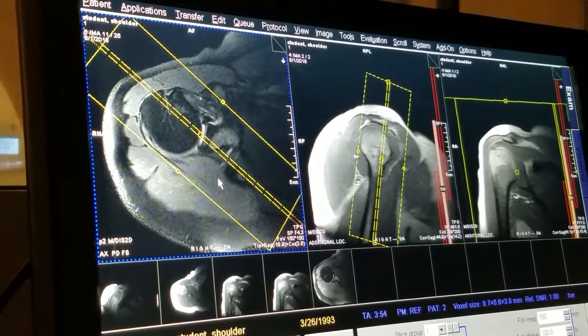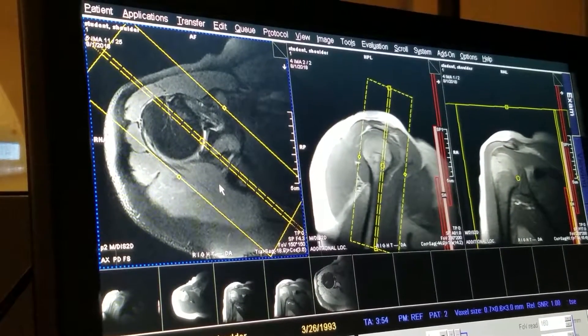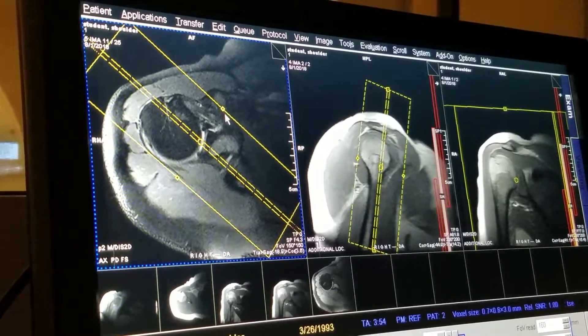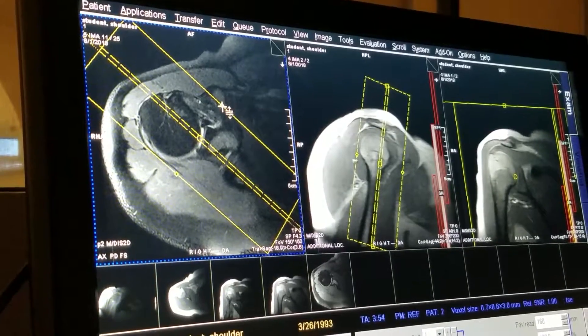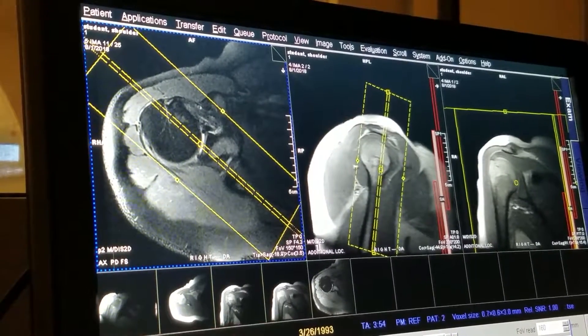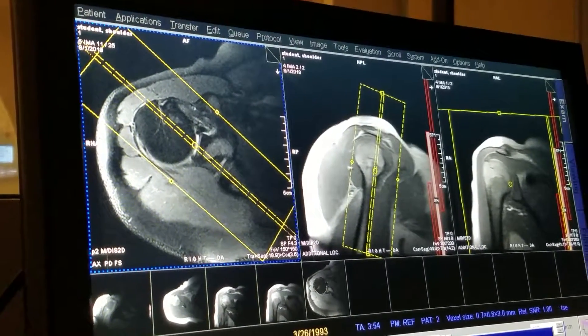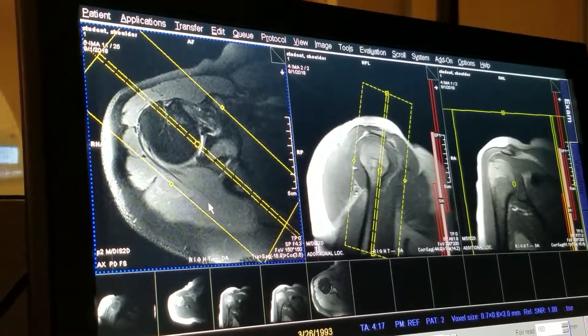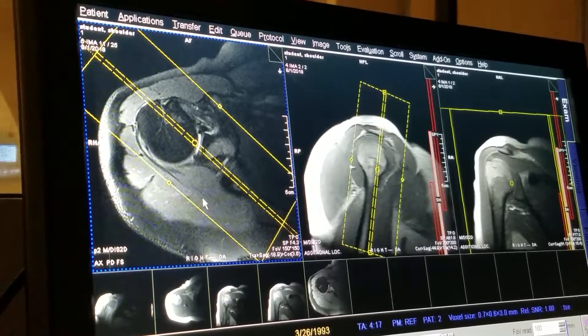Excuse me, not subscapularis — the infraspinatus and the teres minor muscle. Subscapularis is anterior. You're going to want to make sure that you're covering anteriorly from the coracoid process to a few slices behind where you see the humerus, so that you're covering the infraspinatus and the teres minor muscle.